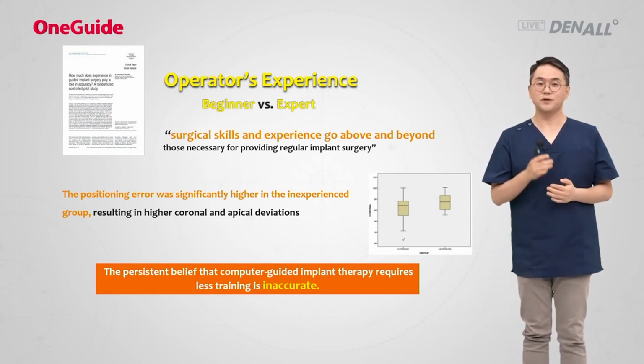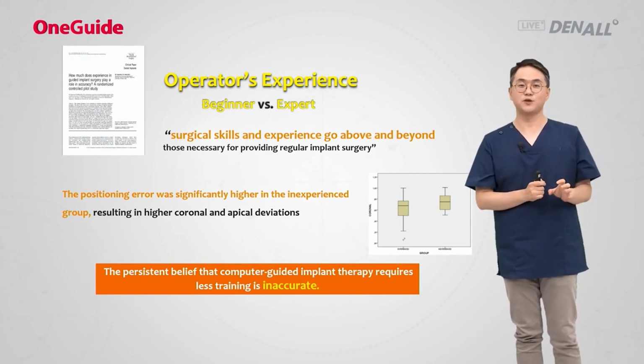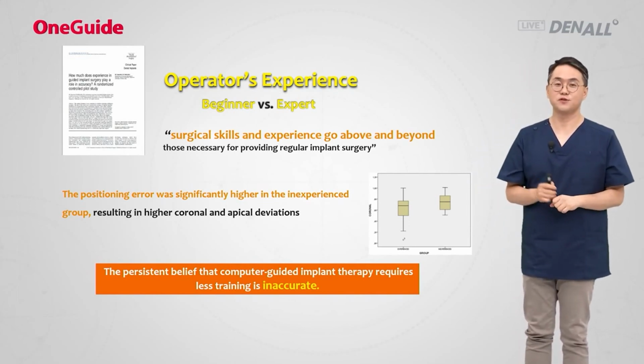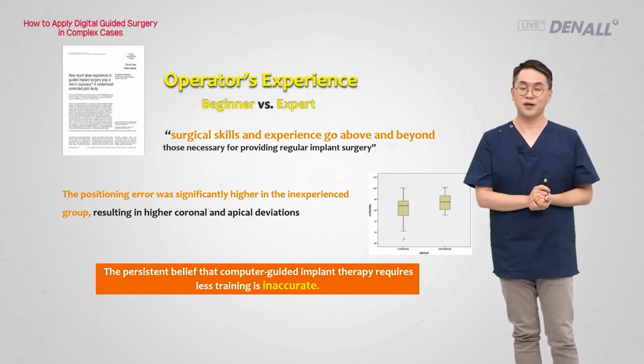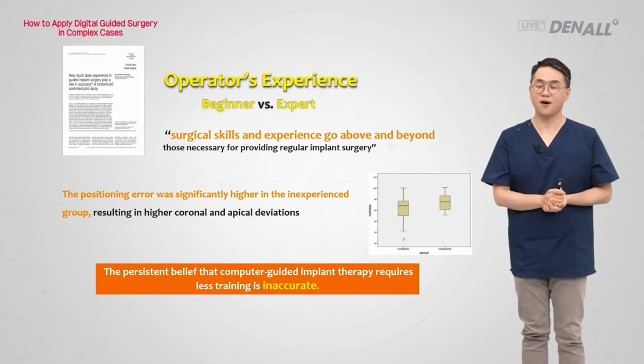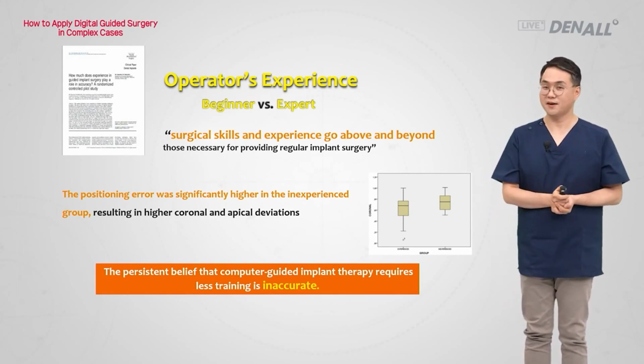Up to now, in the 5 lectures, I covered digital guided surgery, clinical applications in the upper and lower anteriors, sinus lifting, using crestal approach, multi-teeth missing cases, overcoming limitations, providing my clinical tips in brief presentations.